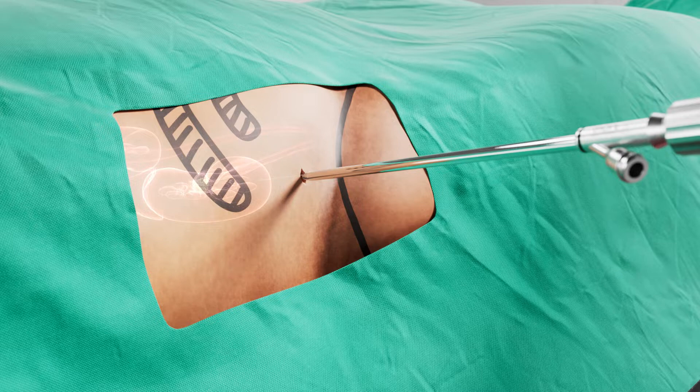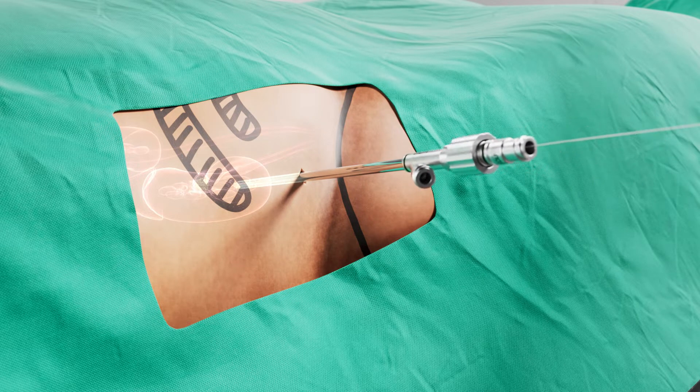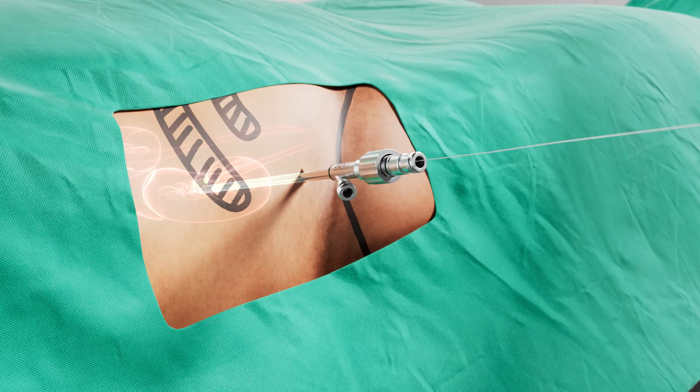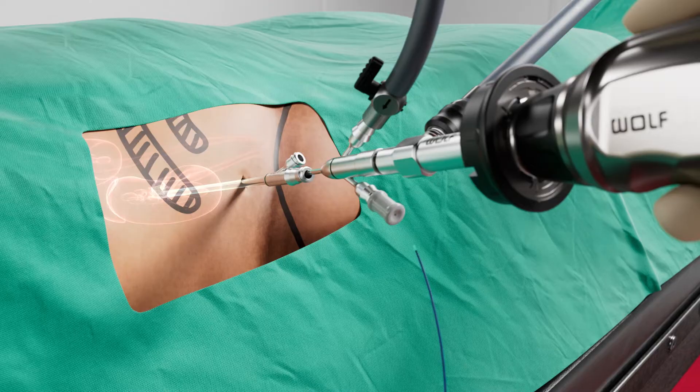Once the obturator and water jet sheath are advanced over the guide wire and guided into the kidney, the obturator and guide wire can be removed so that the nephroscope can be inserted. The Ultra Mini nephroscope is then placed into the inner water jet sheath.